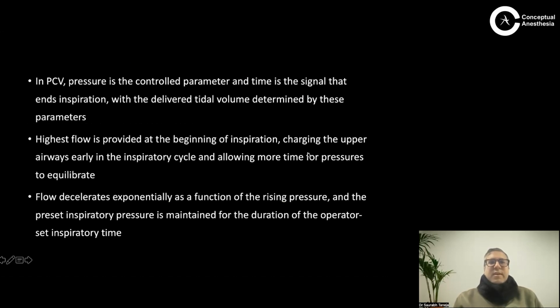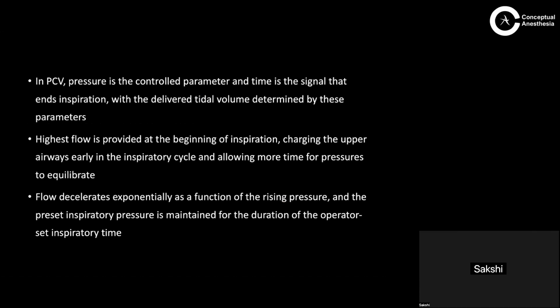So pressure is the control parameter. In the previous talks, we talked about the control parameters and the other parameters which we need to monitor. So in pressure control ventilation, the pressure is the controlled parameter, and time is the signal that ends inspiration, with the delivered tidal volume determined by these parameters as well as how the patient is behaving.